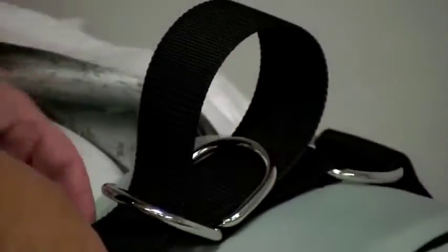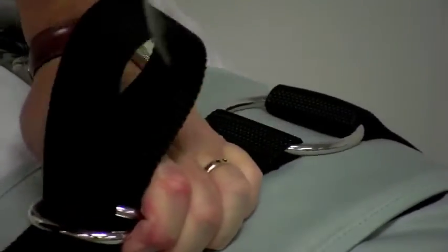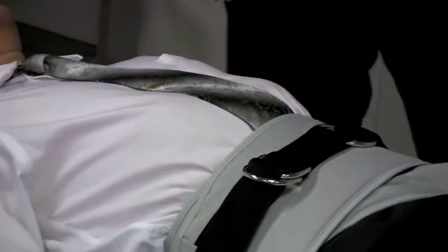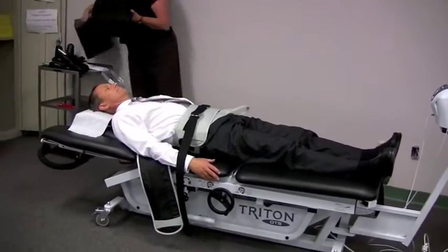Put it through here. Okay. How's that feel? Snug? Okay. Once that piece is in place, I want his low back to be more relaxed.